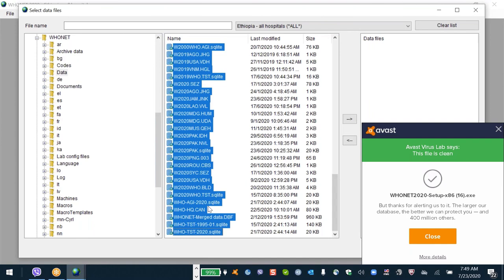Over, it's just easier to deal with one file rather than multiple years. So is that distinction clear? There's no requirement ever to use this feature called combine, but it can be convenient if you're just getting too many files and you just want to combine them together. For example, what I do when I'm doing a research project is I will have one file per hospital per year. So if I have 10 hospitals, 10 years, I have 100 files.